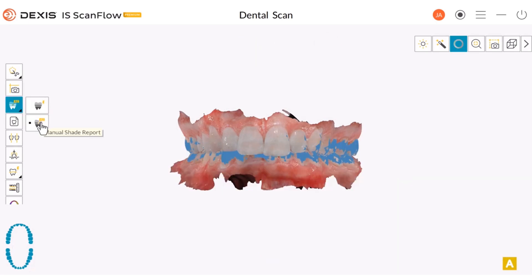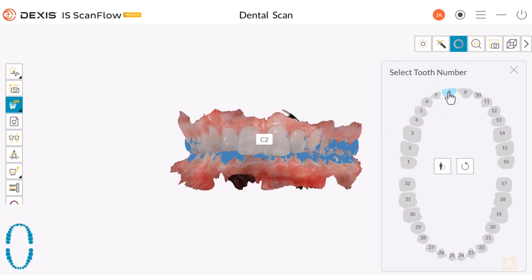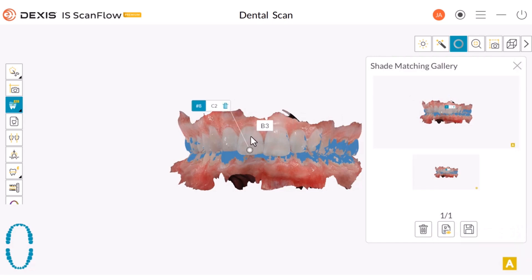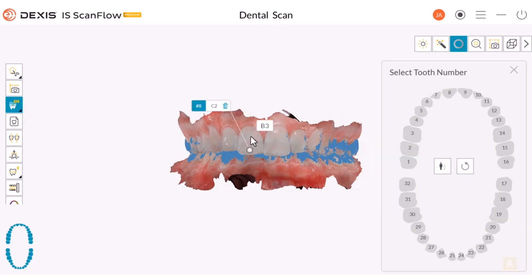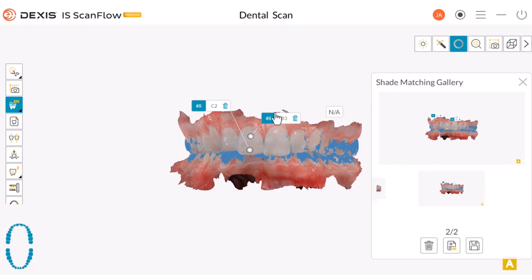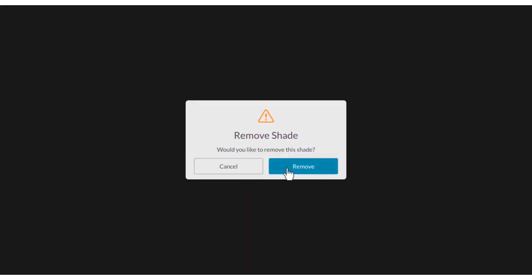To create a manual report, choose Manual Report and select the tooth numbers from the pop-up window — it will create a JPEG in the patient's chart. You can select multiple teeth as needed to add to the report. To avoid the tooth selections from stacking on top of each other, move them as needed. To delete the images, click the trash can icon next to the tooth number.